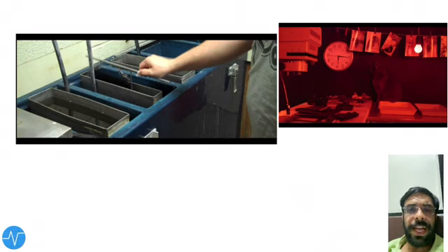So we'll revise how dark room chemistry occurs. We have a radiographic plate made up of silver halide, in which the silver ions are bonded with the bromine ion, and during its making there is a sensitivity speck, which is an electron acceptor. When the X-ray hits this silver bromide, an electron is removed from the bromine ion and goes to the sensitivity speck as it is an electron trapper. This positive silver ion goes towards the sensitivity speck, picks up an electron, becomes a silver atom, and forms the latent image.